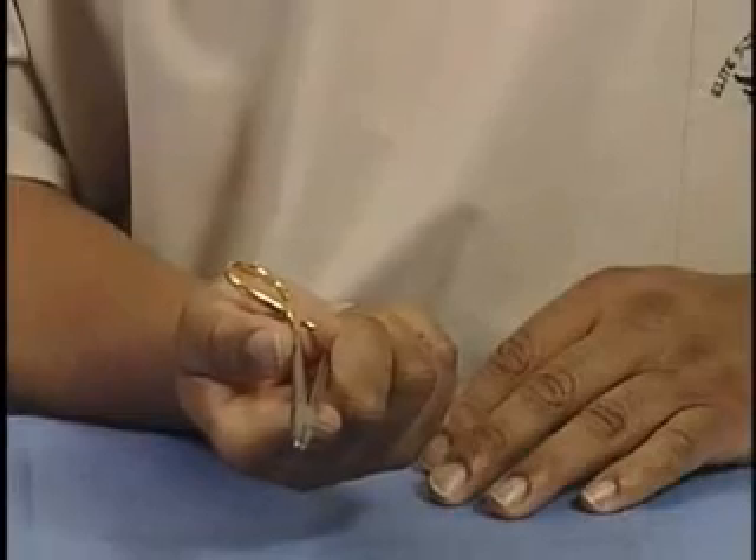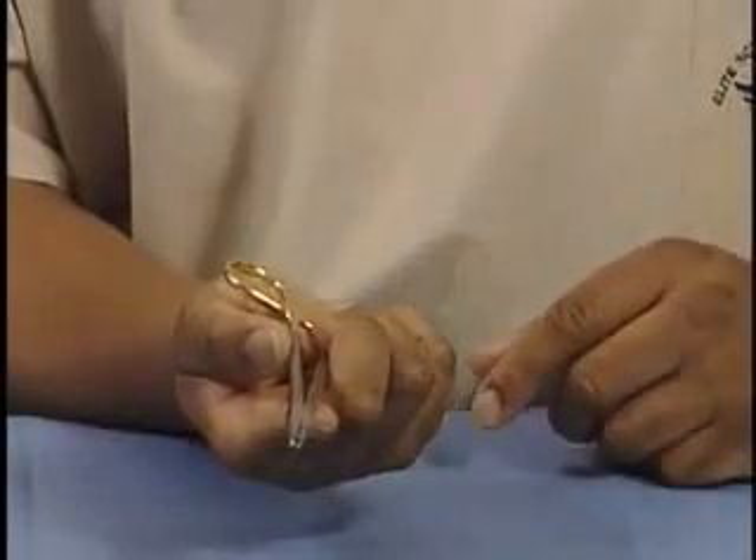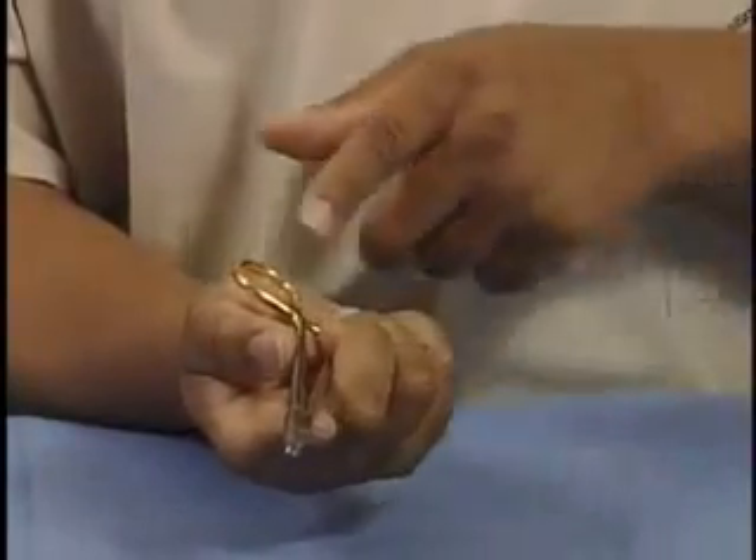To open and close the needle driver using this method, push towards the palm with the pinky, ring finger, and middle finger.